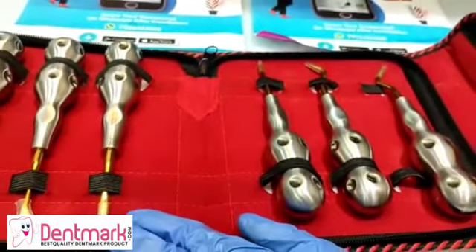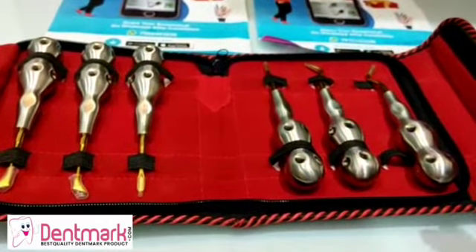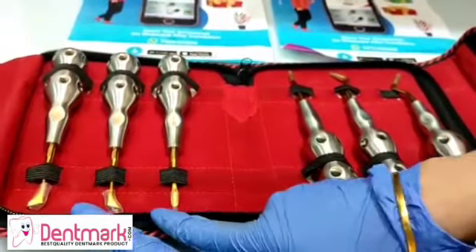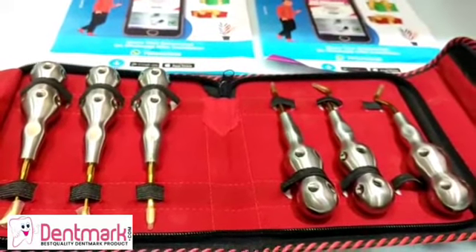The straight type — as you can see, the blade of the straight elevator is very commonly used to luxate or loosen the teeth. Apart from this, the triangular ones are also very commonly used and are provided in pairs, left and right.